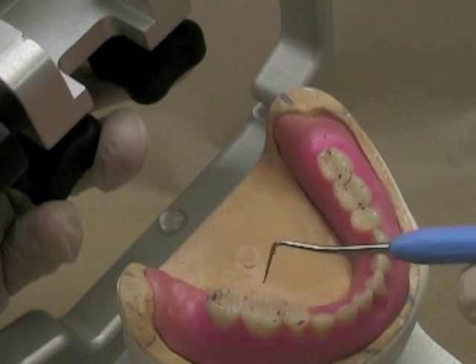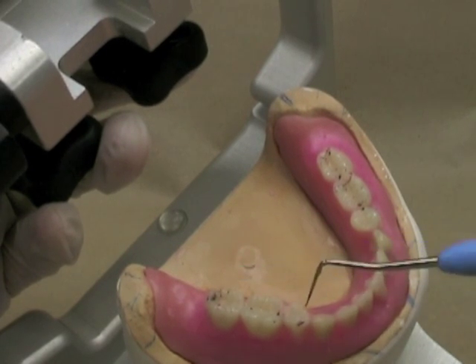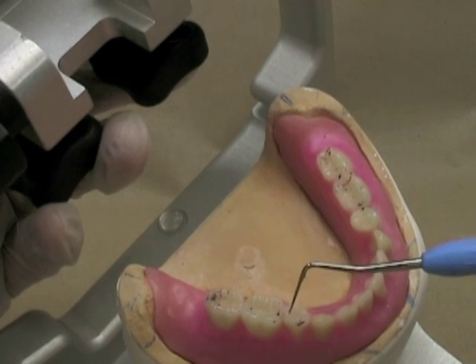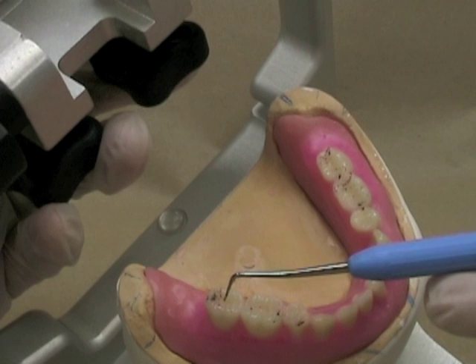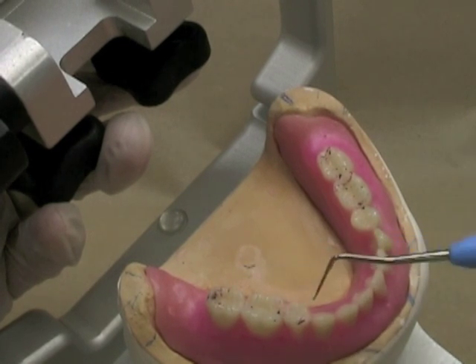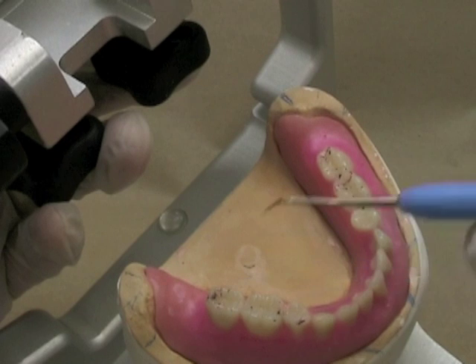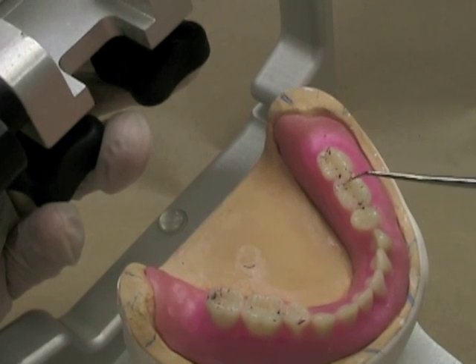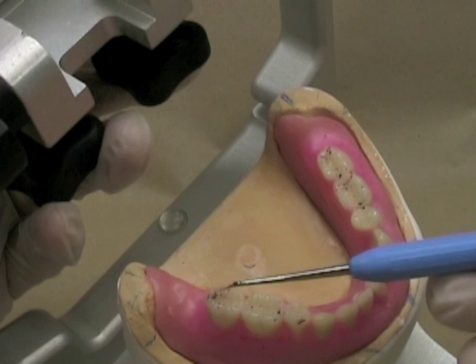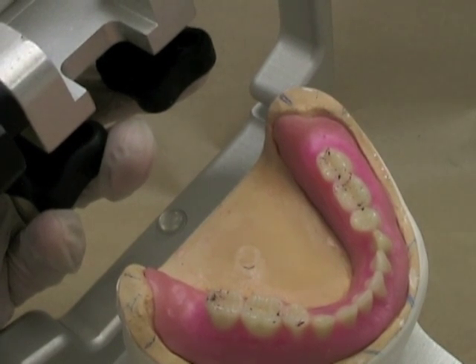You can see over here this tooth has no contact in working or in balancing. This one has a good working contact and in fact it's the only working contact on this side — it's probably causing a jump. It's causing the maxillary lingual cusp to come up and jump over this cusp and none of these other cusps are touching. The balancing contact here is only on this one tooth. Remember this is an inner incline of a functional cusp, so this is the balancing contact that corresponds to this working contact over here. Let's start by lightening up some of these contacts so we start to get the working and balancing contacts on all of our posterior teeth.